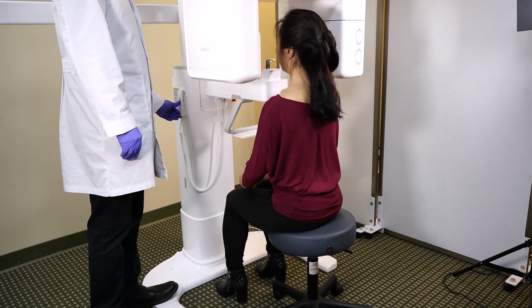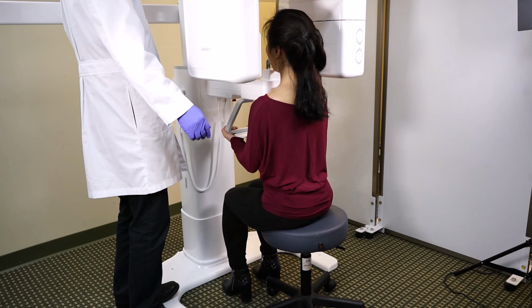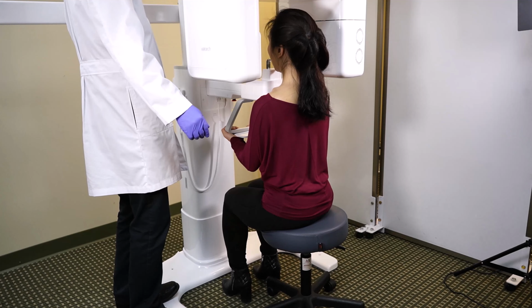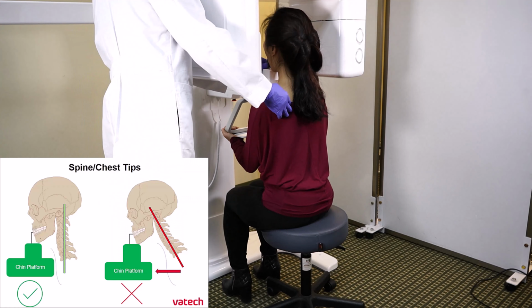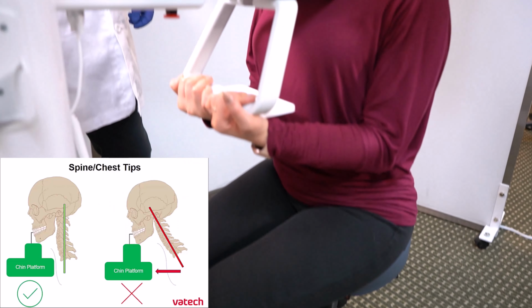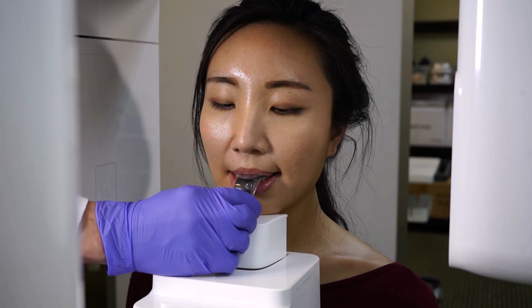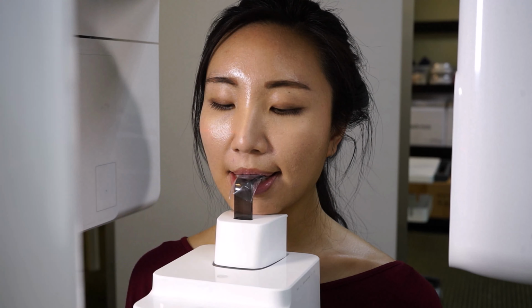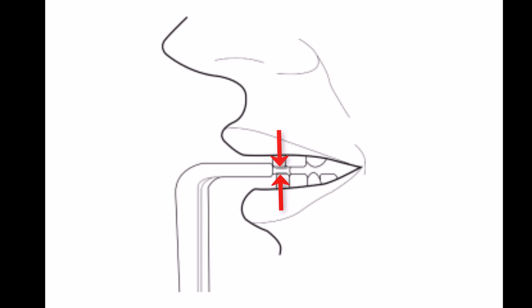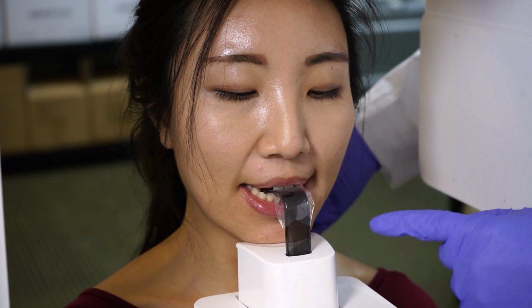As you have the patient roll into the machine, have them hold the handrails with their palms facing up. Keep the feet at shoulder width apart for stability. Ideally, we want the patient's spine to be as upright as possible and the chest close to the device during image acquisition. With a clean vinyl bite stick cover, have the patient bite in the bite stick firmly in place. Ensure the teeth are firmly in the grooves. As a tip, pull down on the bite stick to secure the patient.